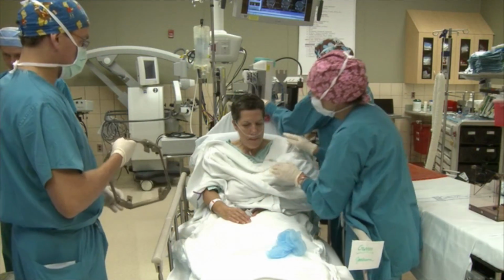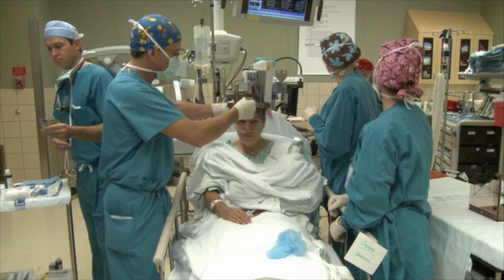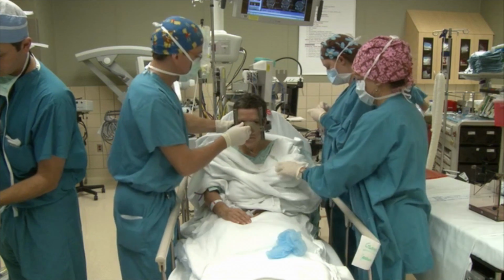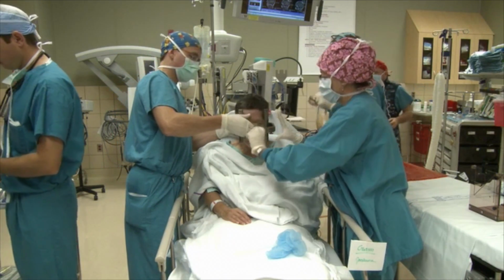So I think right now we're going to show a surgery that we did recently on a patient. This is a woman who has a strong family history of essential tremor and underwent DBS surgery a number of weeks ago. This is patient Vicky, and this is the day of surgery, and we have already obtained imaging, an MRI scan of the brain, and used that to make sure that she's a good surgical candidate.